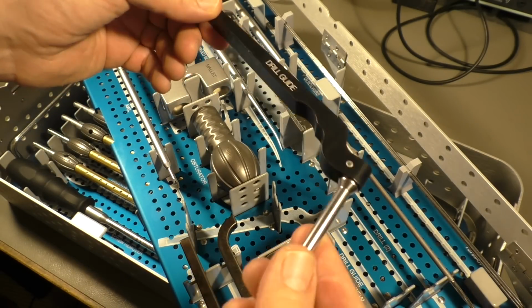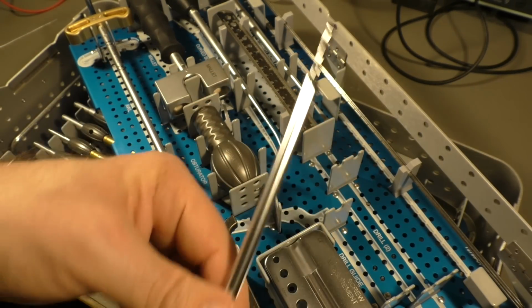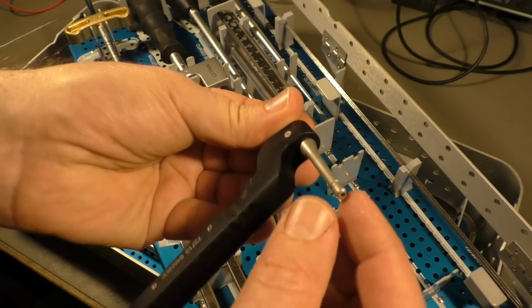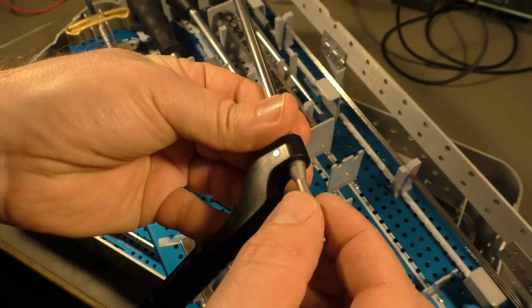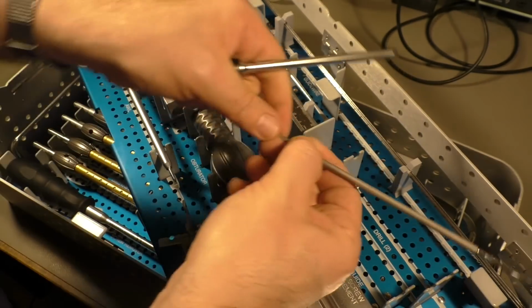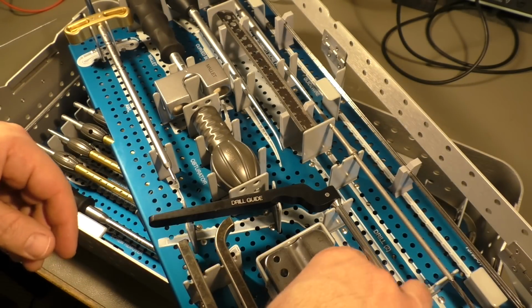There is a drill guide, which has the function to guide that drill to the right position, of course. And what's missing, for example, is the drilling machine. I think there is some kind of electric drill, which is not included in this set.